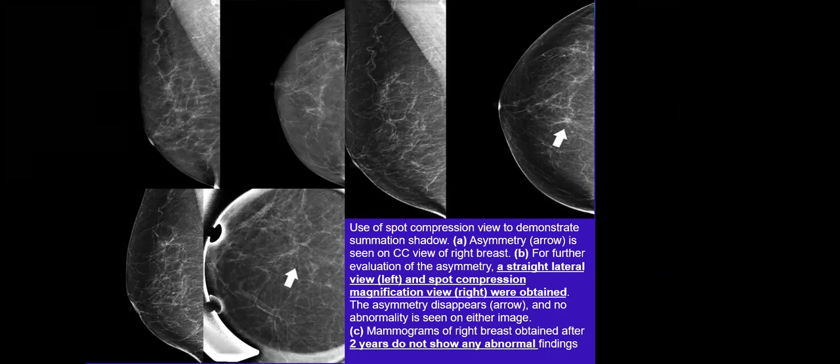In the previous lecture you started mentioning the arc, that we should measure the distance between the lesion and the nipple, and then we draw this. Before that, we were talking about the lesion locations and the probability of them disappearing or appearing in the other view. What are the factors affecting the visibility, the disappearance or non-conspicuity of the lesions in the other view?